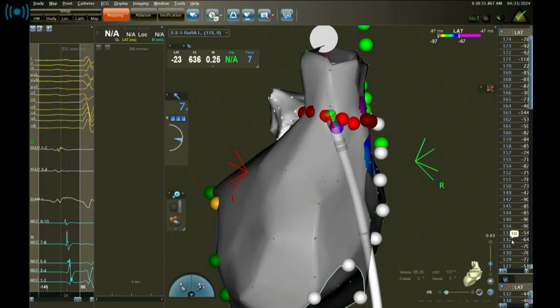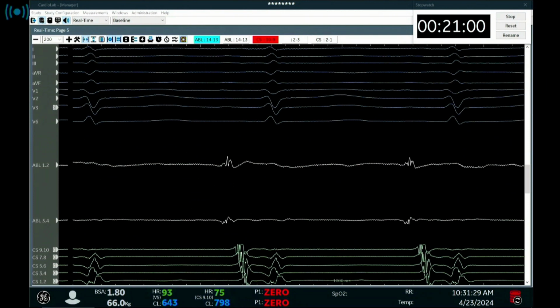Because there is temporary sinus nodal denervation, which goes against what we want to achieve during the procedure. But fortunately, it is temporary, because when you look at our live screen, you see that our sinus rate is only 93.